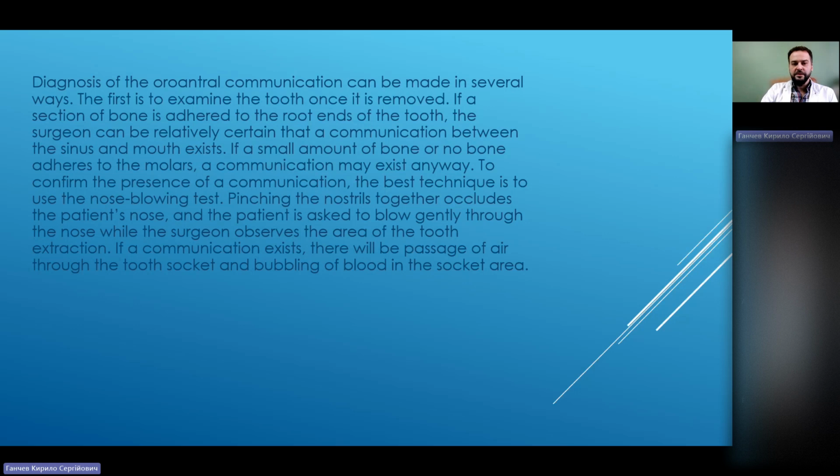The surgeon occludes the patient's nose, and the patient is asked to blow gently through the nose while the surgeon observes the area of the tooth extraction. If a communication exists, there will be a passage of air through the tooth socket and bubbling of blood in the socket area.